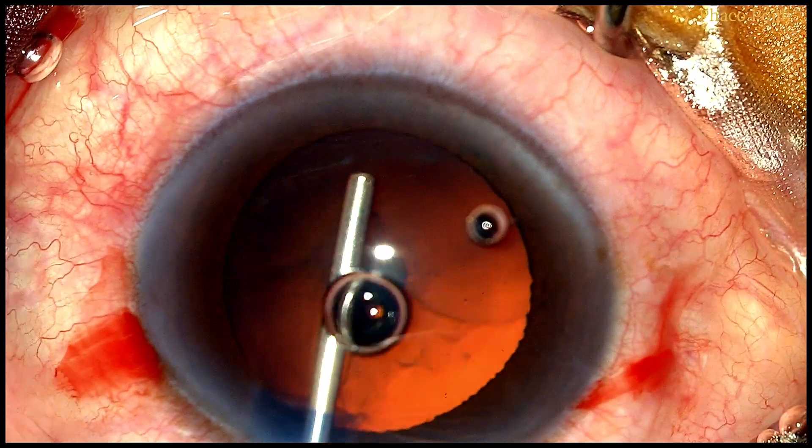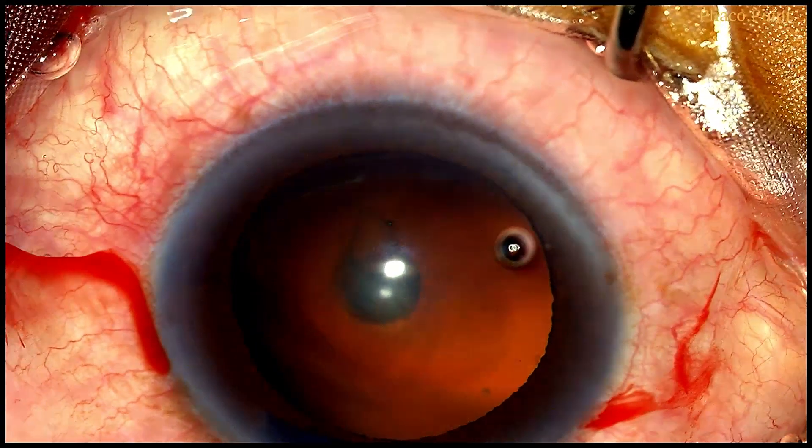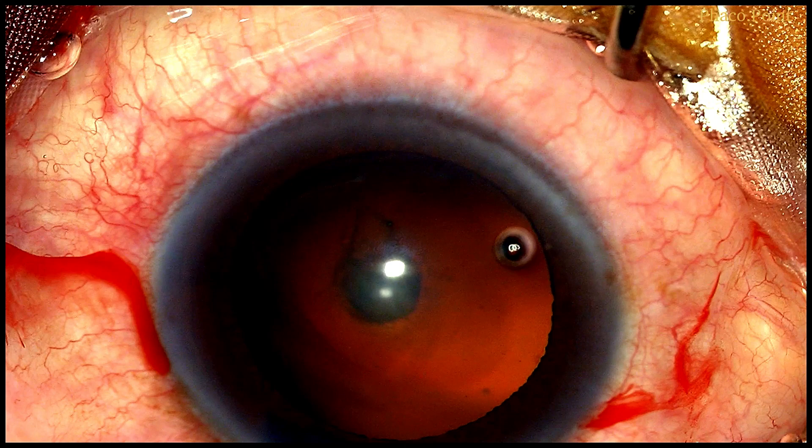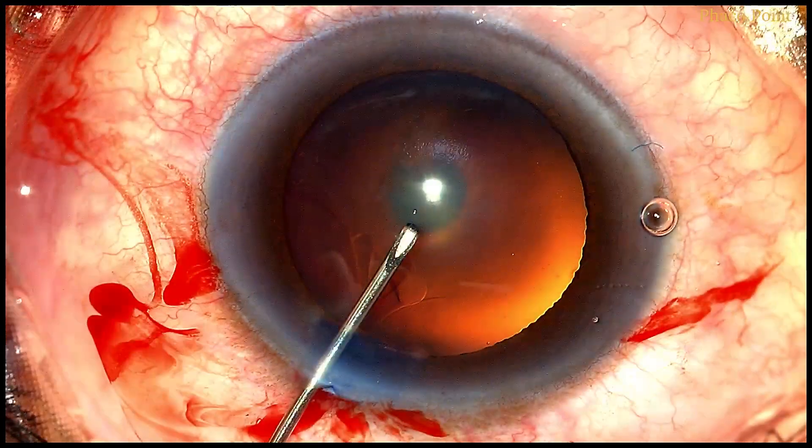I like to stain the anterior capsule with blue dye because it aids visibility while performing the capsulorhexis. Following this, some viscoelastic is introduced into the anterior chamber to flatten the anterior capsule, after which we use a well-fashioned cystotome introduced into the anterior chamber to proceed to create the rhexis.